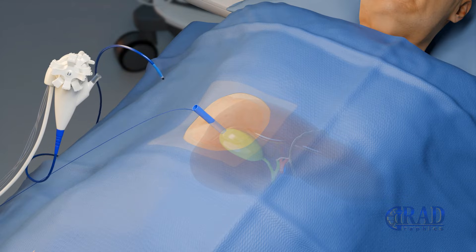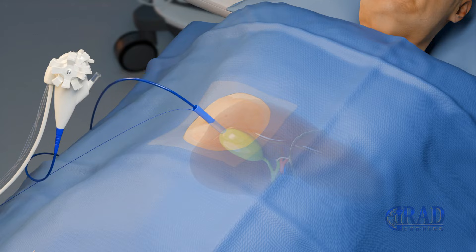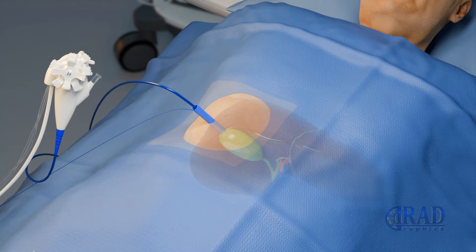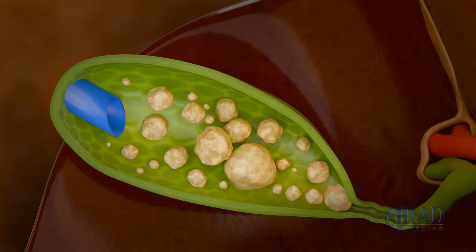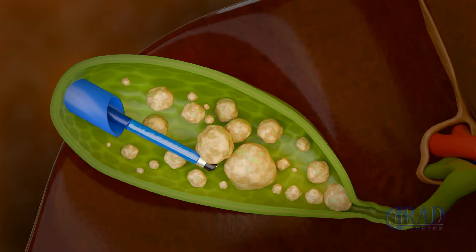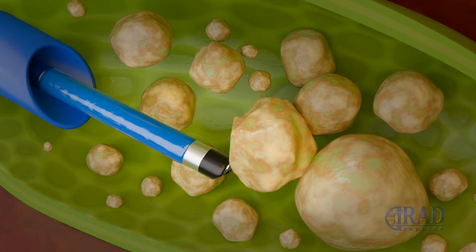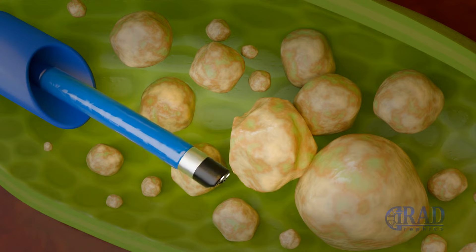Through this Nephromax tube, a single-use percutaneous endoscope is introduced into the gallbladder, providing direct video visualization and guidance to identify the stones.